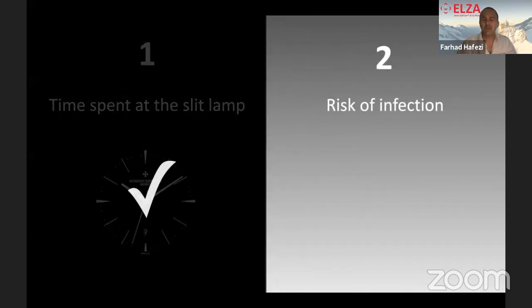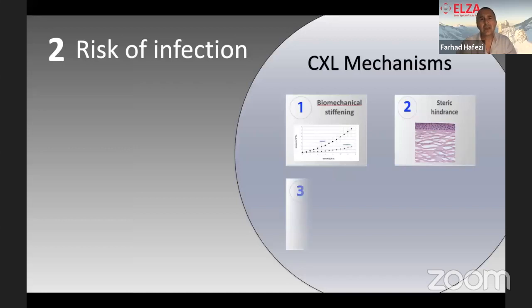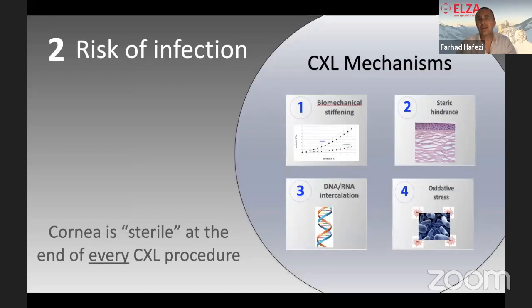What about the risk of infection? Remember my first slide? With every cross-linking procedure, you disinfect the cornea, whether you do keratoconus or keratitis treatment. In other words, if you have a young mother coming in telling you, doctor, my toddler scratched my cornea, it is hurting, could you help me? Well, this cornea is more infectious than a cornea at the end of a CXL or PACK-CXL procedure.